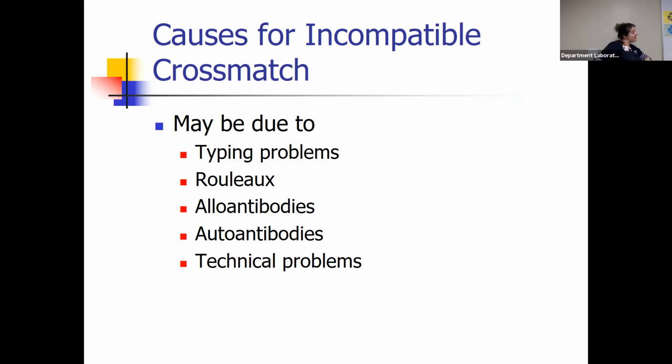Your patient has anti-A1 and you're giving them an A1 unit. So that's gonna cause agglutination in your test tube. So you're probably gonna see a 3+, 4+ reaction at initial spin. All right, because remember A1 is an initial spin reacting antibody, one of our ABO antibodies, okay? So that could cause an incompatibility.